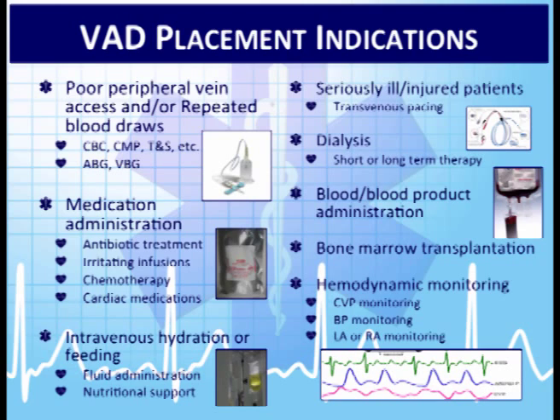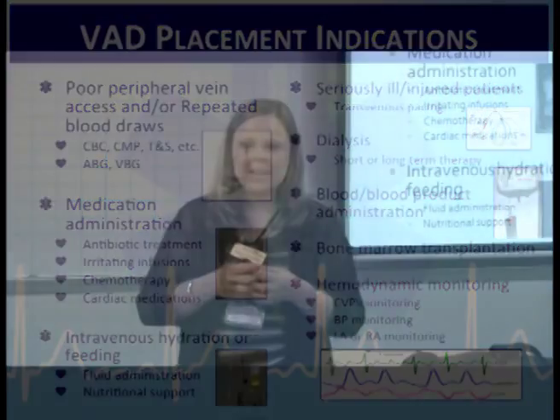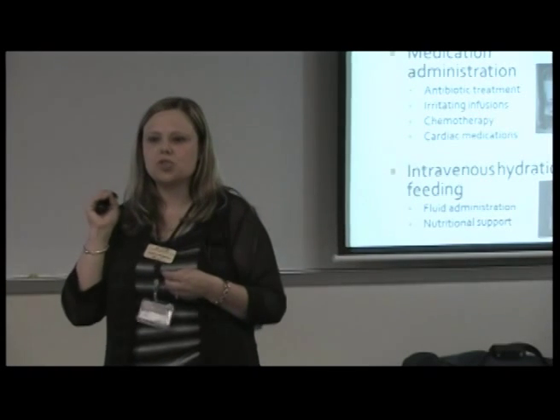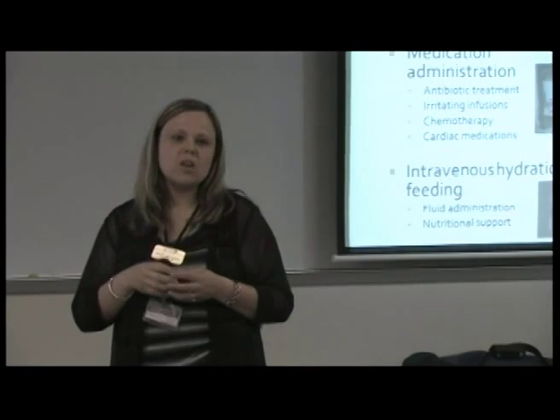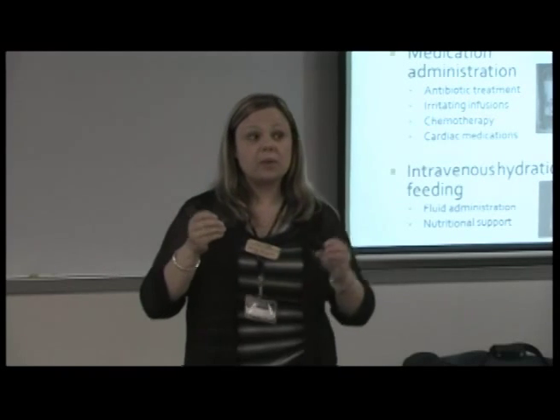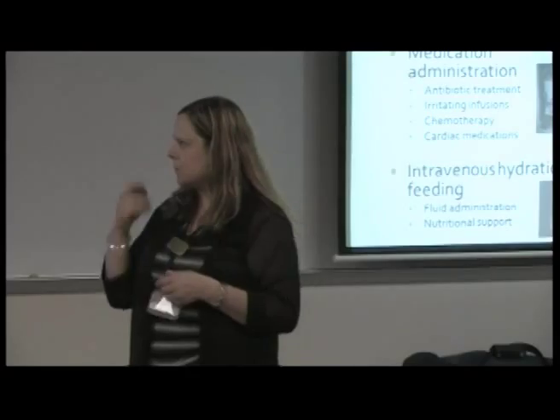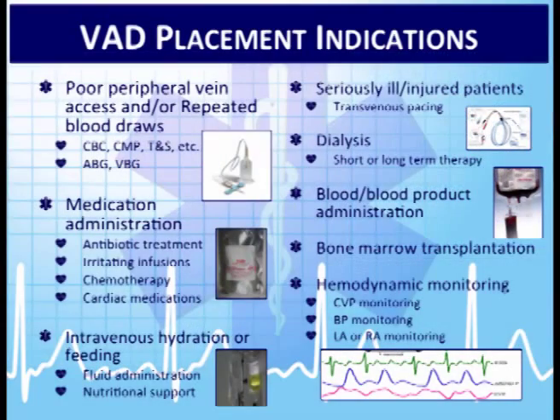An internal pacemaker is not put in right away, okay? They put in transvenous pacing. You guys may see those in the ICU when you go in. That's part of a central line that may be put in the cath lab in the groin, and they are able to do transvenous pacing through the central line catheter, but then we can also use that to give our fluids. So that's like a multi-purpose type of catheter.